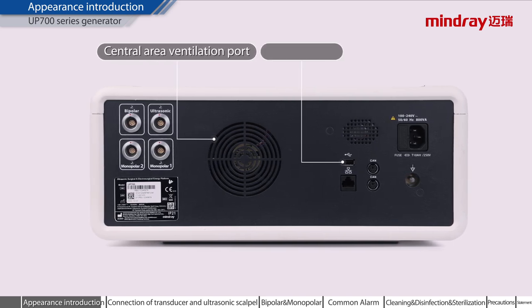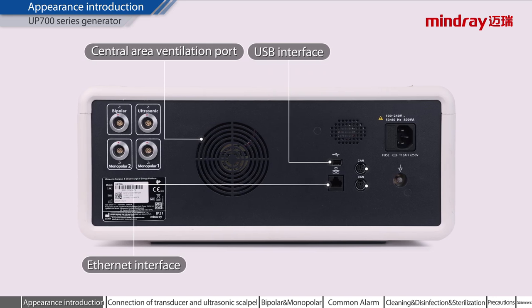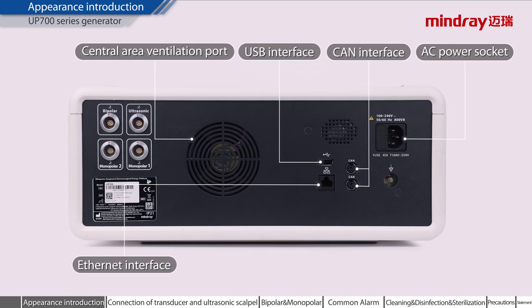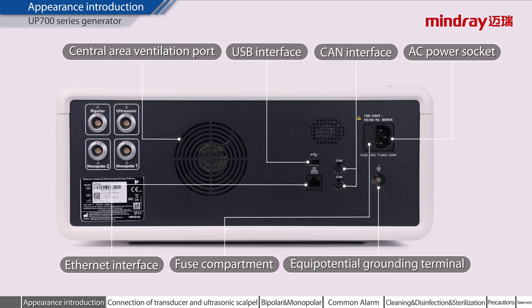USB interface. Ethernet interface. CAN interface. AC power socket. Fuse compartment. Equipotential grounding terminal.